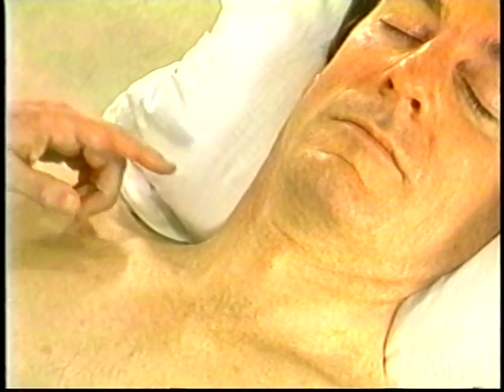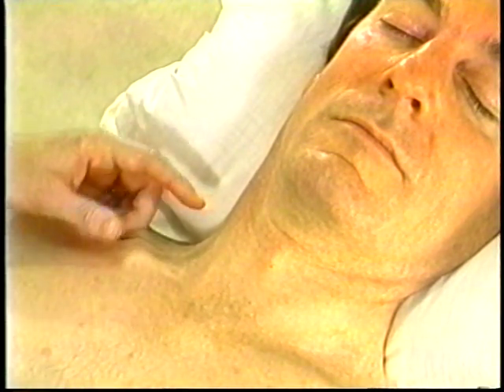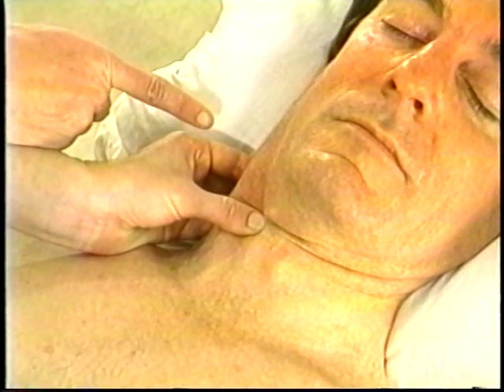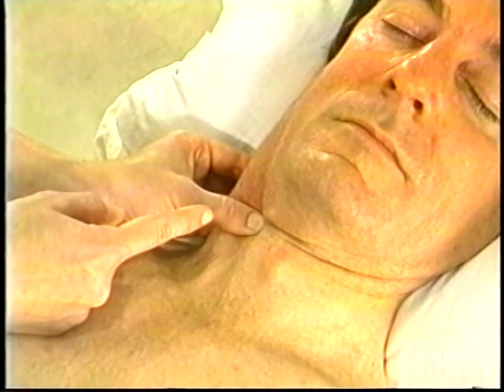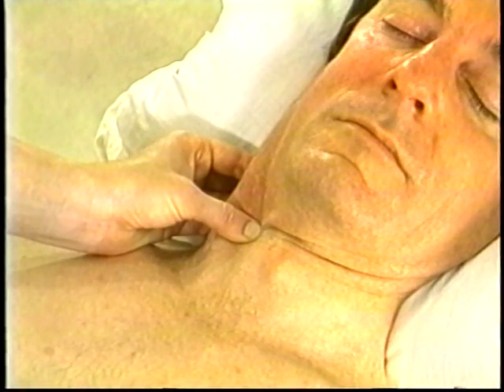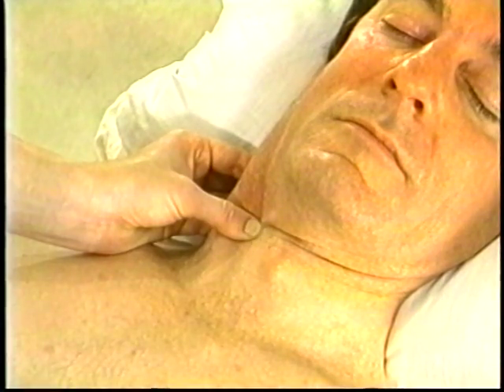In both cases, it is wise to avoid penetrating the muscle in order to sample the mass. Instead, the lump should be held by grabbing around the muscle, allowing the fingers to support it in the back, and the thumb to palpate it directly through the skin in front. Then, without loosening the grip, the thumb is allowed to slide down slightly, stretching the skin over the target. The skin is cleansed, and the needle is entered for sampling.